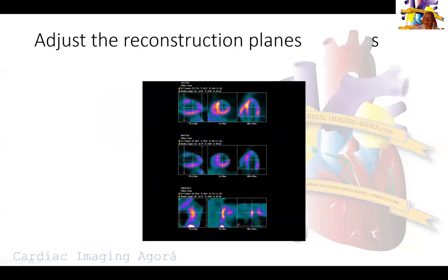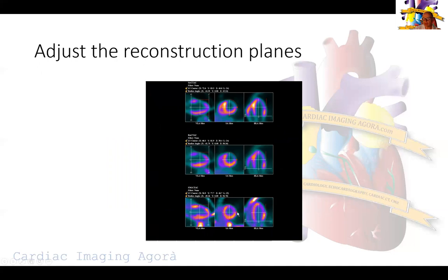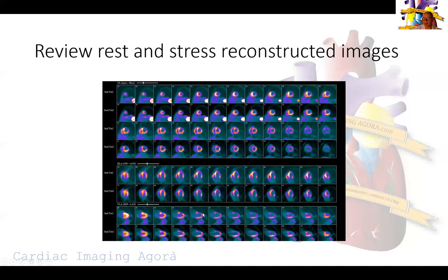Then we go to the construction planes. On the stress images on top, rest in the middle — the software picked up the ventricle boundaries quite well. In the FDG images, as often happens, the software went off over into the GI. The heart is actually up here, so we have to realign it by dragging it up. Now you can see: stress on top, rest in the middle, and FDG on the bottom.